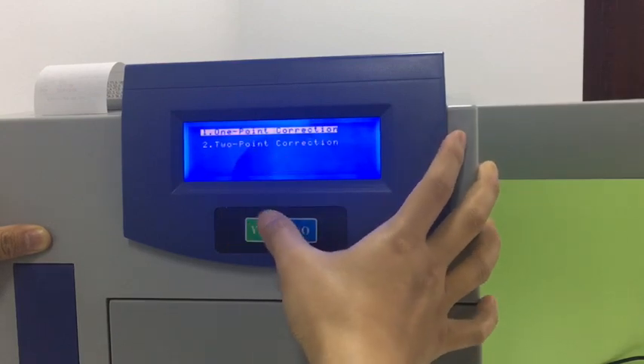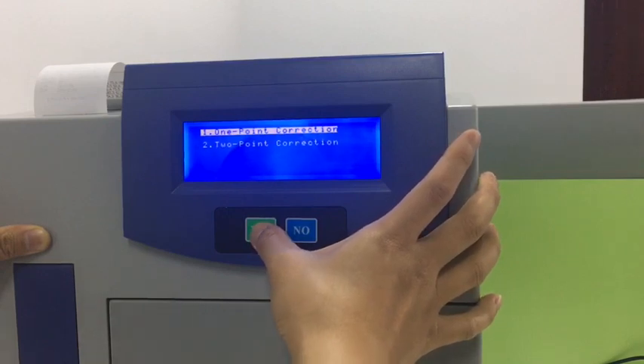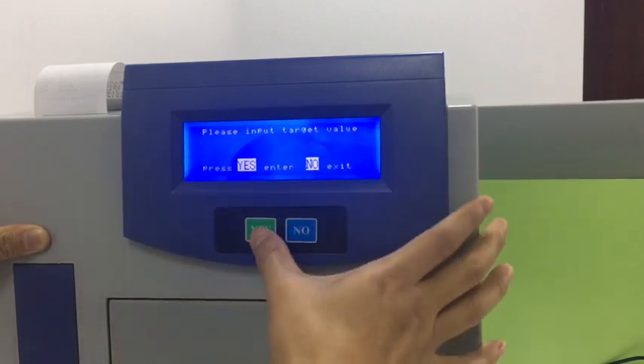Then we use one-point correction and press yes, because we need to set the target.